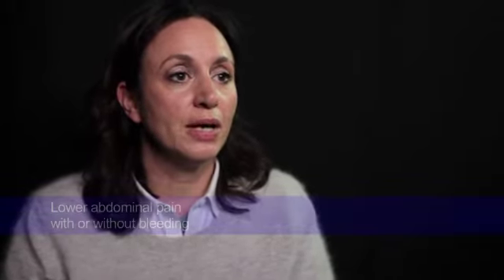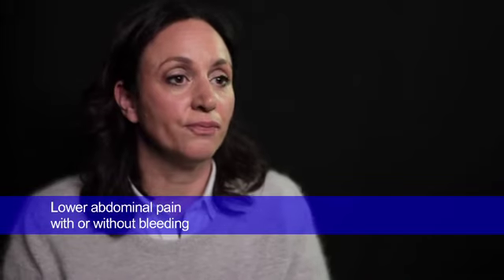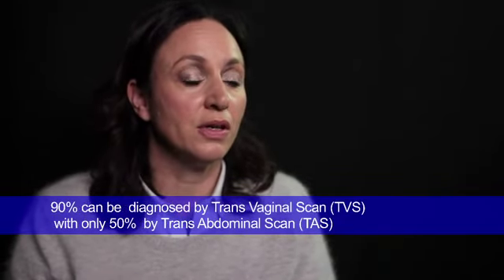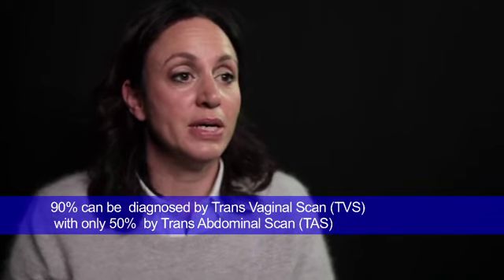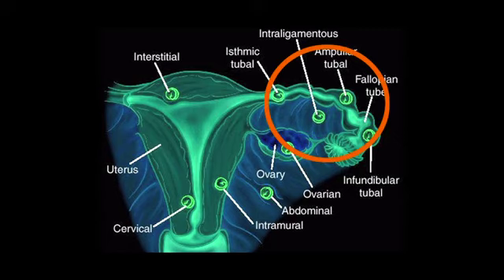Okay, so ectopic pregnancy, as we've said, presents with lower abdominal pain, with or without bleeding. 90% of ectopics can be diagnosed by transvaginal scan, as compared to only 50% by transabdominal scan. The term ectopic pregnancy refers to an aberrant location of pregnancy at implantation. So as you can see in this slide, there are many locations for an ectopic pregnancy. Classically, it's tubal in the fallopian tube. It could be at any point along the fallopian tube.